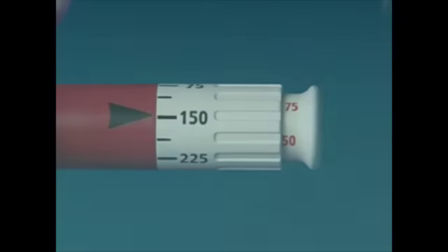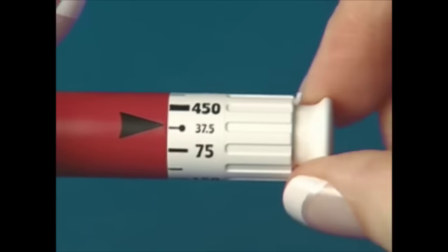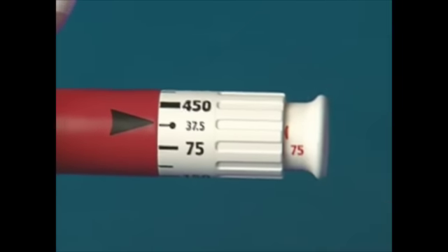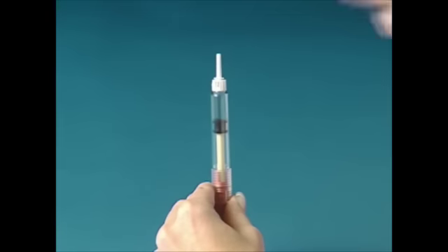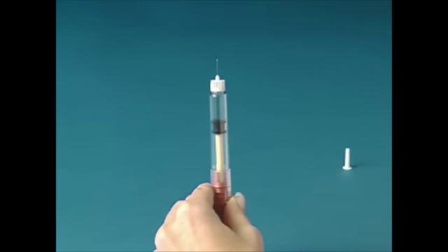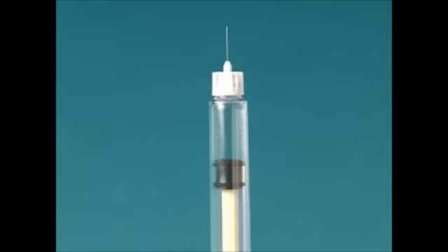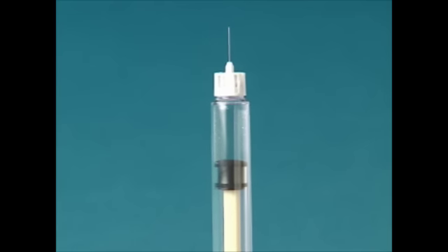Priming the pen — first use only. Set the dose arrow at 37.5. Pull out the injection button as far as it will go. Remove the inner needle cap, but do not throw it away — you will need to replace it after priming the pen. Hold the pen so the needle points upward. Gently tap the pre-filled reservoir with your finger to let any air bubbles rise to the top. It's normal if a few small air bubbles remain.